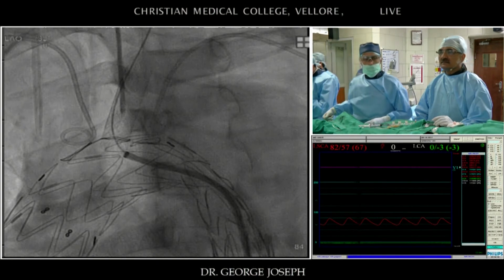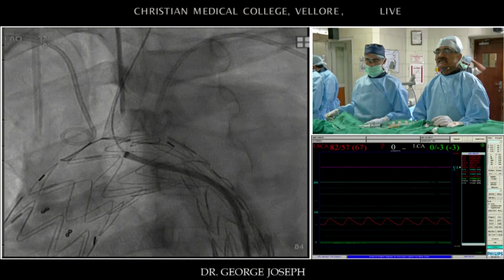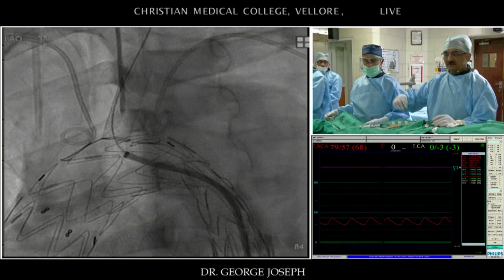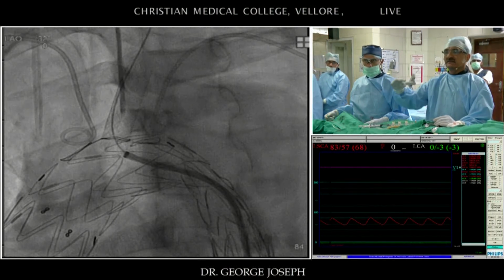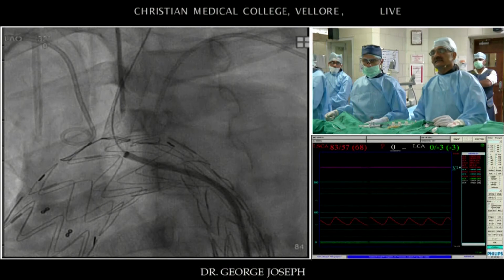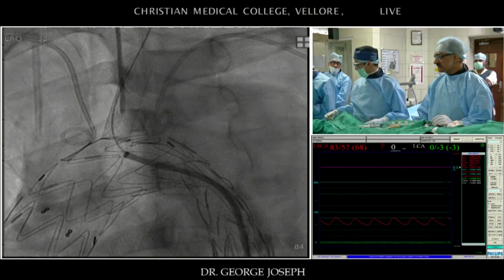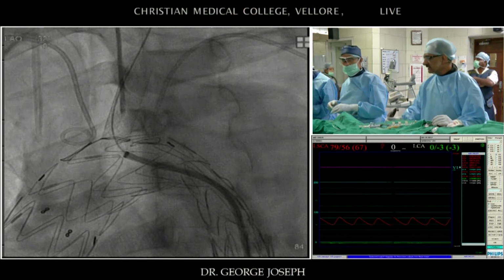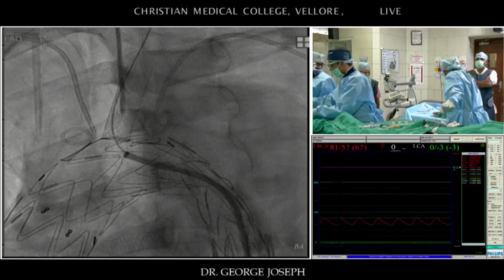Are there any other tricks that you can do at this point to try and reduce that risk? Yes, I could buckle the wire down the ascending aorta a little bit so that it enters the Zilient stent more coaxially. Now when I'm coming from the descending aorta, it's hitting the side of the Zilient stent. That's what happened the first time. I think pushing the wire will help you.